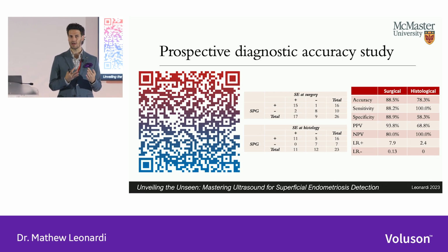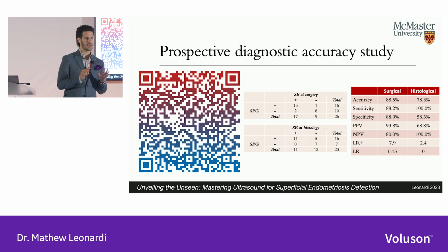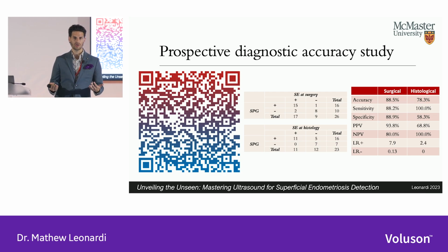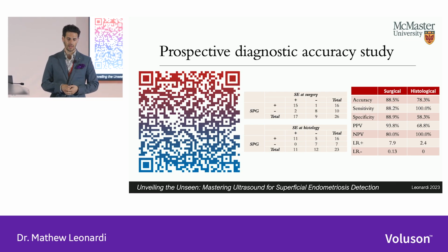Again, as we know, not every diagnostic test in endometriosis or in general is perfect. So we wanted to evaluate it very critically against 2 reference standards. This was the strength of our study and something that we haven't really been seeing that much of in other diagnostic test accuracy studies in endometriosis, whereby most groups, most people publishing in this space, are believing of the surgeon. If the surgeon says it is, then the surgeon is correct, but maybe we should be a bit more critical. So that's what we were doing here.